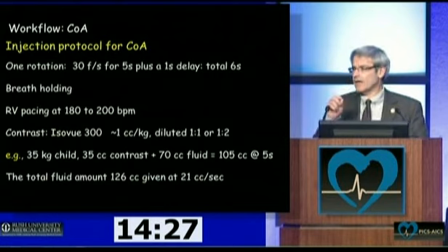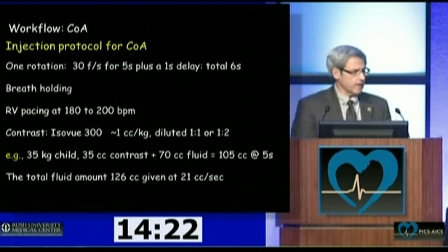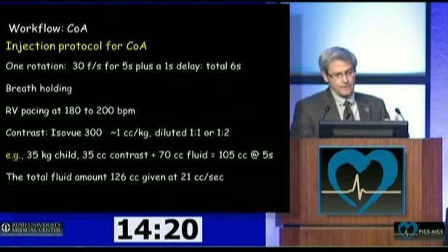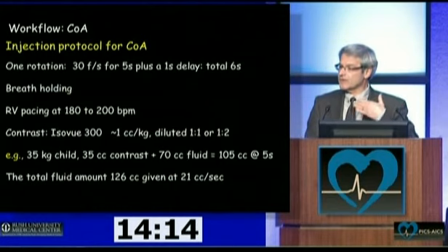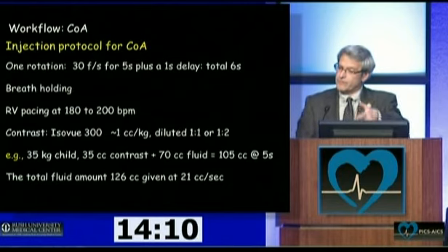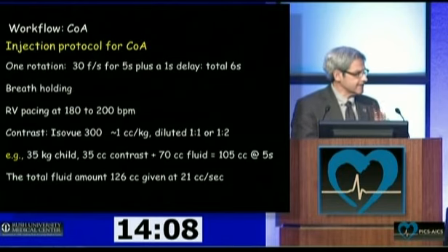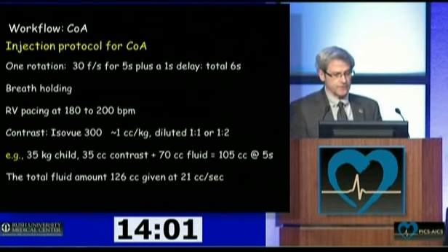So just as a technical note, all the systems are a little bit different. Carlos mentioned the way he does it: 30 frames a second. You do a 5-second rotation with a 1-second delay, so the injector begins the injection for a second before the rotation. So it's 5 seconds of acquisition, but 6 seconds of injection.